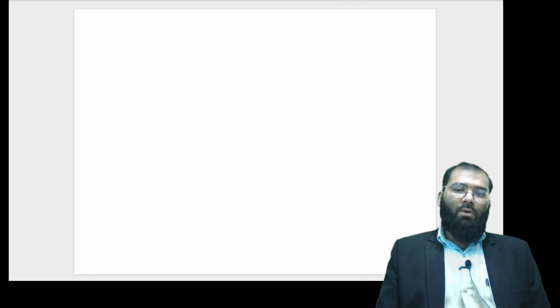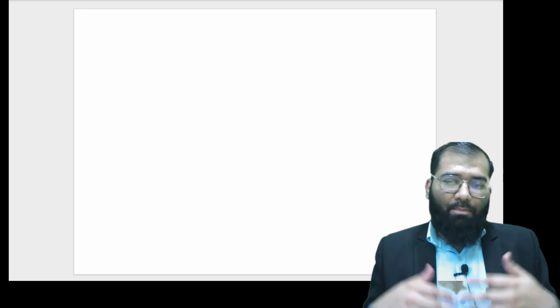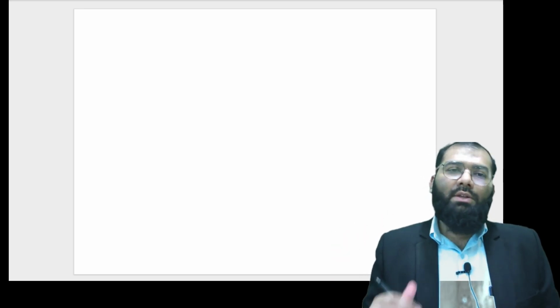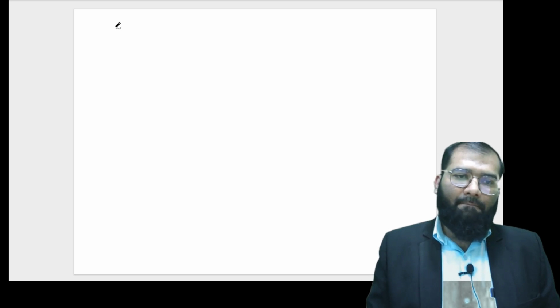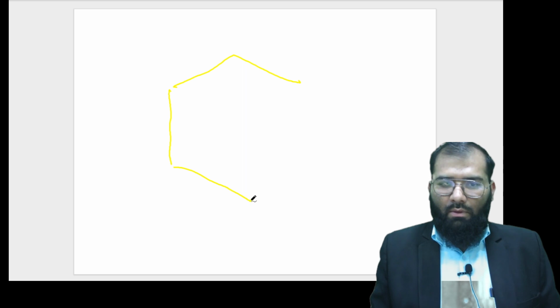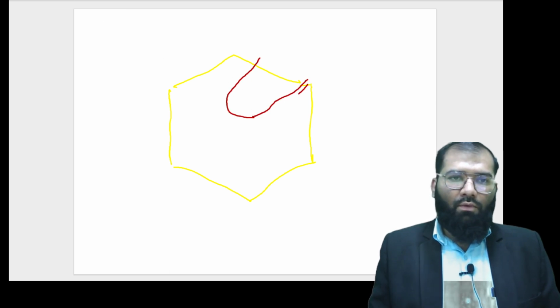Now I hope the indications and how we should approach a patient with a spleen problem have become very clear to you. Just to summarize in this slide, you should look at the spleen from four different angles.